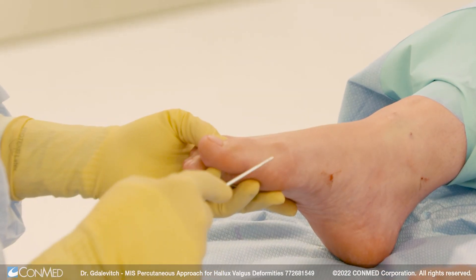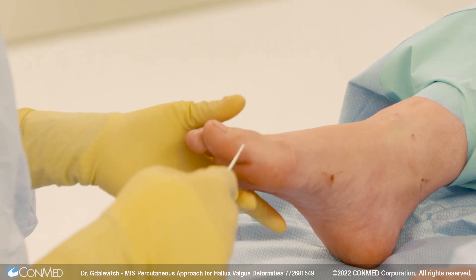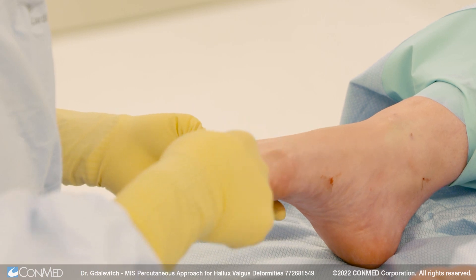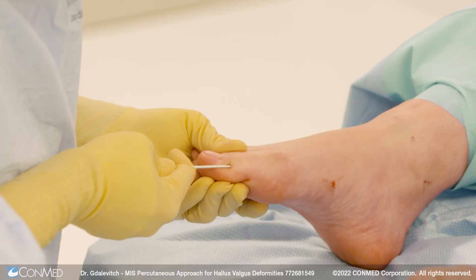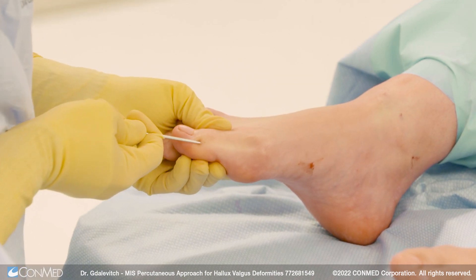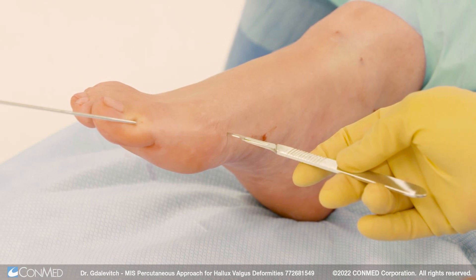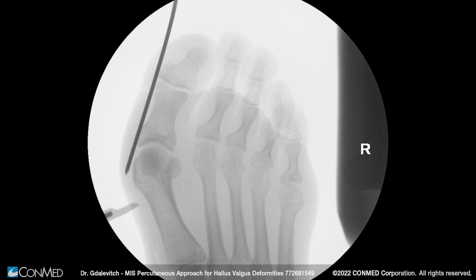The wire is inserted at the base of the nail bed at the intersection where the plantar and the dorsal skin come together. The wire should be pushed directly down to bone and then follow the bone under the skin all the way to the bunion. Once you see the wire sticking out, you can pull back a little bit, and that's going to help for our incision. The incision is made under fluoroscopy at the metaphyseal-diaphyseal junction, and you can see on the radiograph that the wire is stuck directly down to bone.